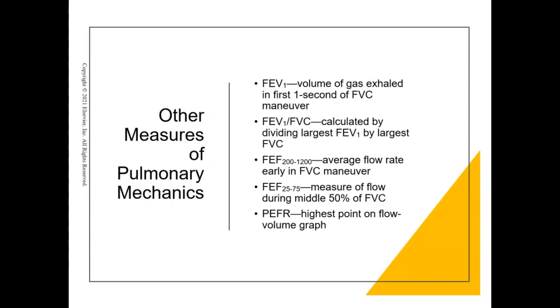In order for me to record all the results, I need to have at least three tests with my forced vital capacity being within 5% of each other and my FEV1 being within 5% of each other. Then I'm going to make sure my test was valid, meaning there was no cough, no leak around the mouthpiece, and no extrapolation that made the test invalid. Then that's considered 3 acceptable trials, right?